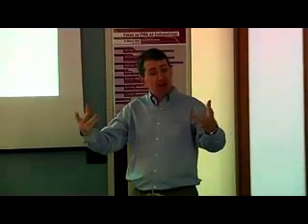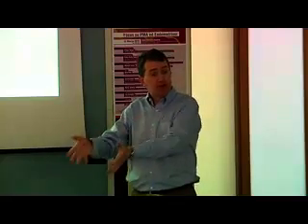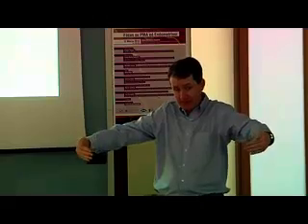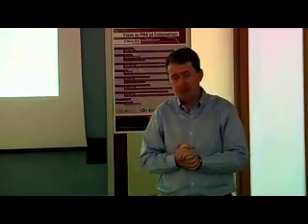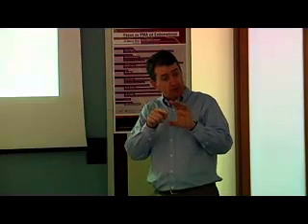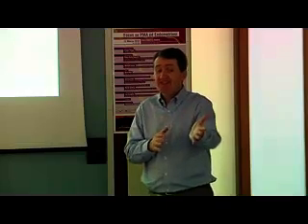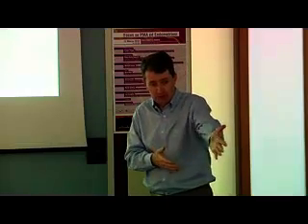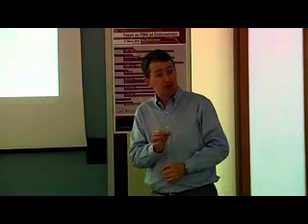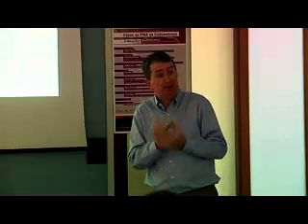If the embryo has started to hatch from the zona, it tends to be more fragile and it collapses on its own just from pure handling. It's those big expanded guys like the day 6 fully expanded blastocysts or really advanced embryos of day 5. So you can stick an ICSI needle in there, and you can either suck out the fluid or you can just make a hole and allow the fluid to drain out. There's actually an even easier way than that to do it, which Michael talked about in our talks yesterday. You can put the embryos into a solution, some medium containing 0.1 molar sucrose, and that'll collapse them right down.